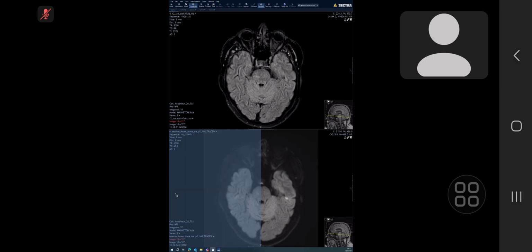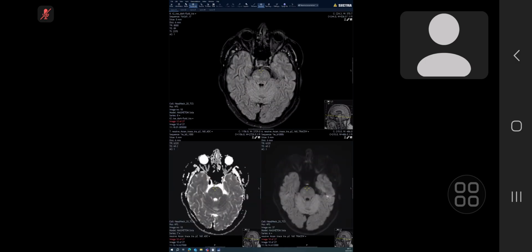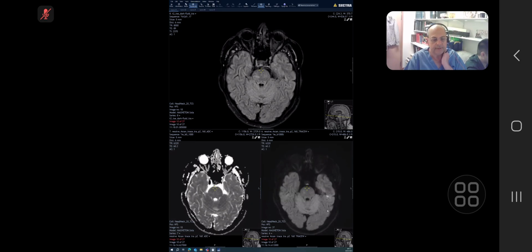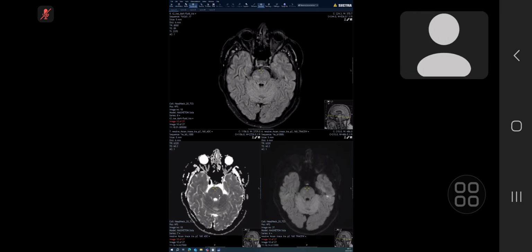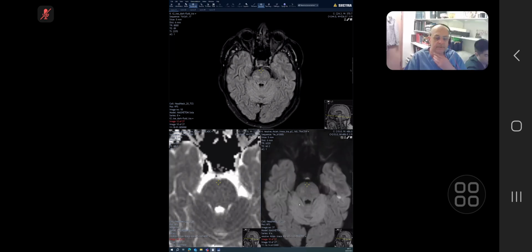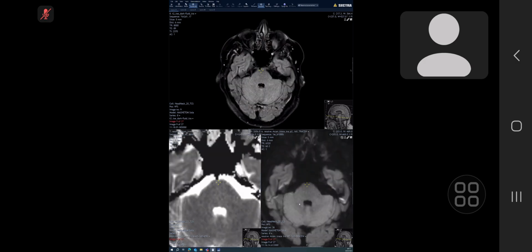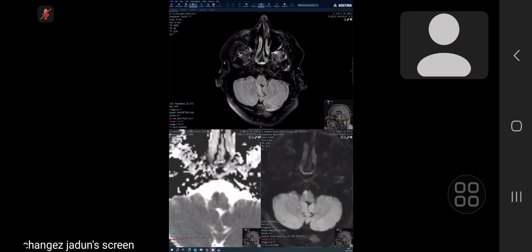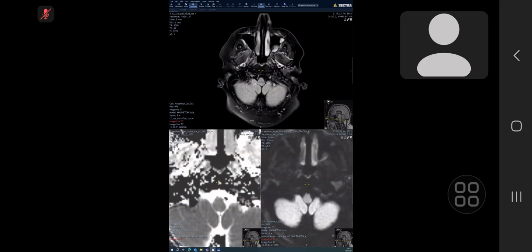Maybe, maybe not. Nothing very obvious. No corresponding ADC hypointensity. No other areas of restricted diffusion.